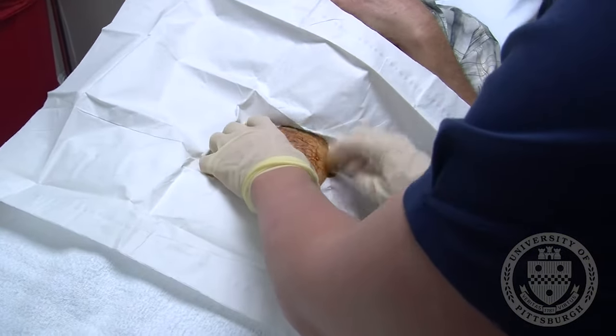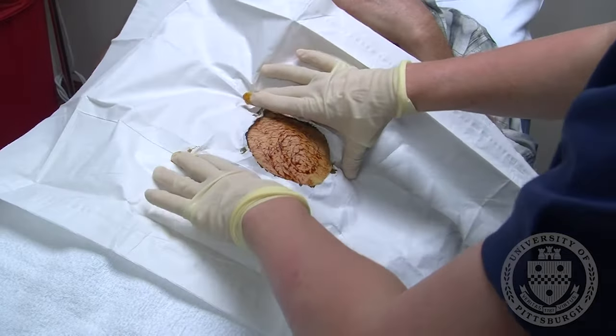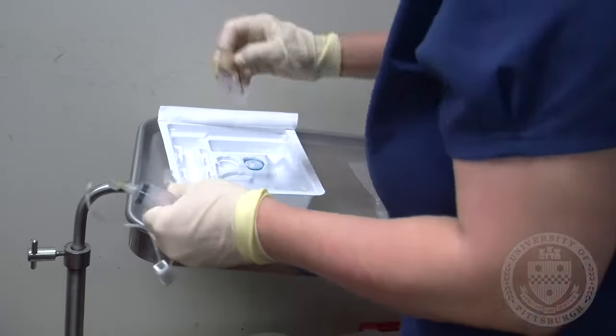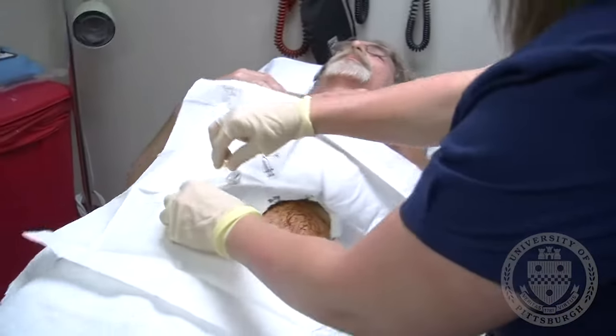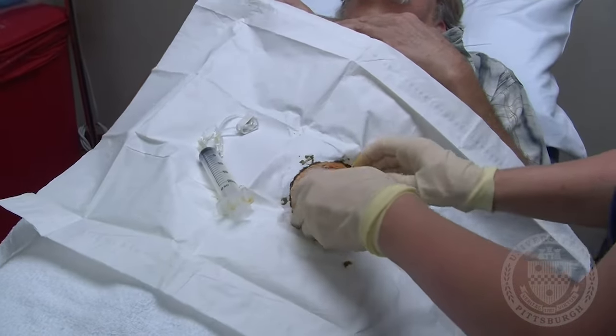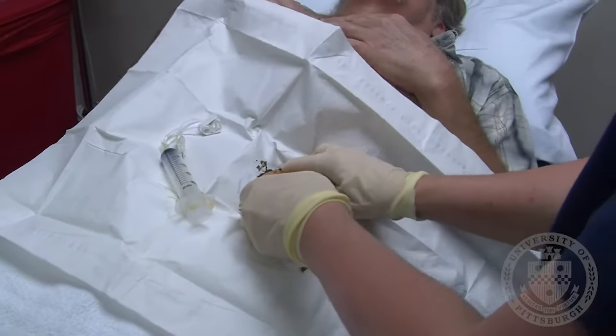The provider again palpates your abdomen to check the orientation of the pump. A template is placed to locate the exact site of the port.